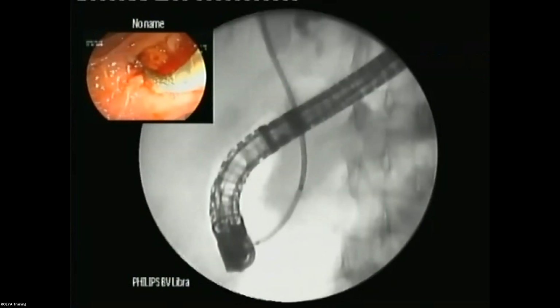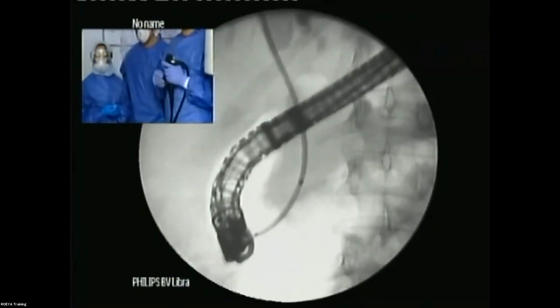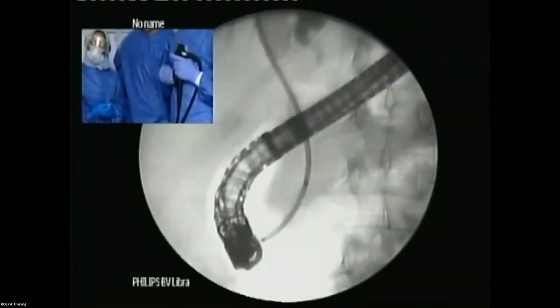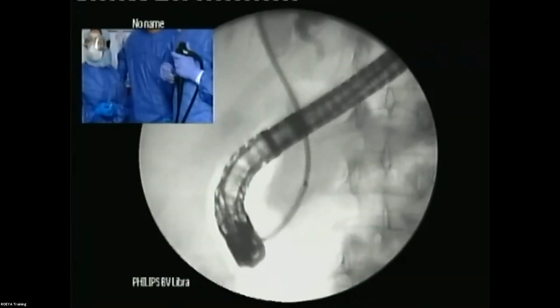We can see here the lower part. Yes, this is the most important thing. You have the endoscopic view and the radiological view, so you can manage everything. We have the endoscopic view.